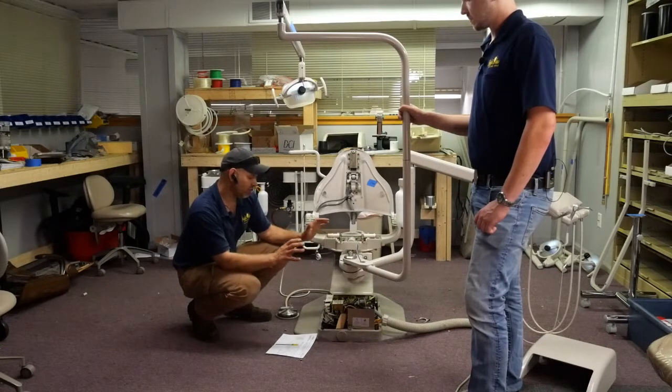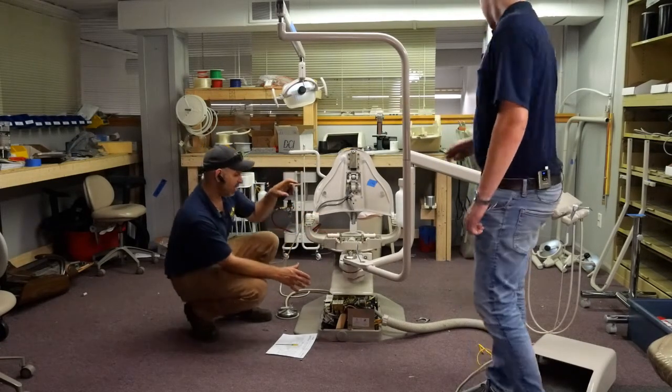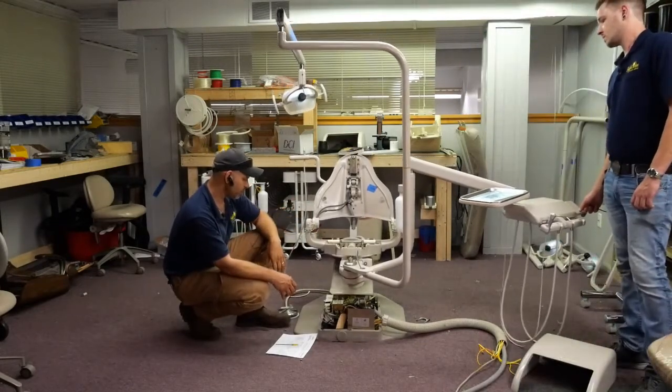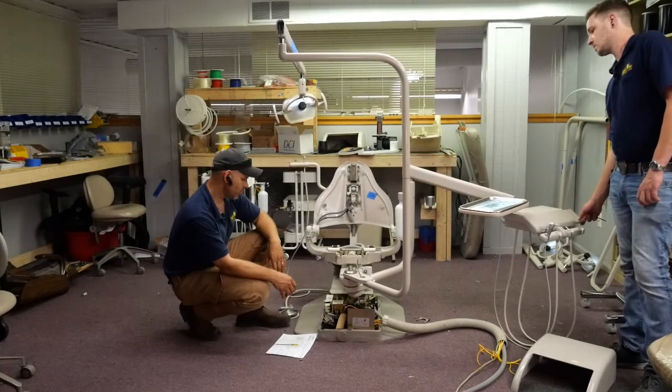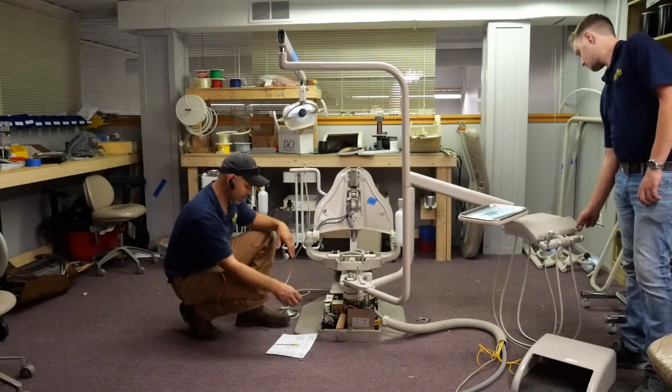So in order to actually do that, go ahead, Calvin, and lower the chair all the way down. All right, and then lower the back all the way down.